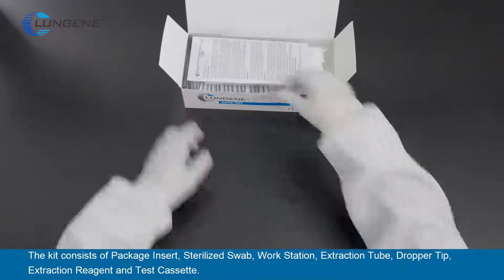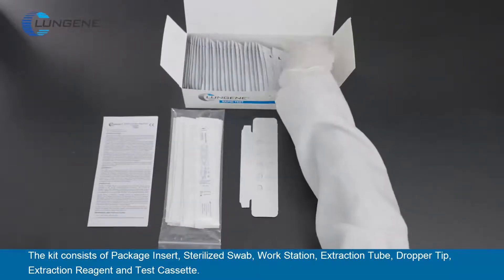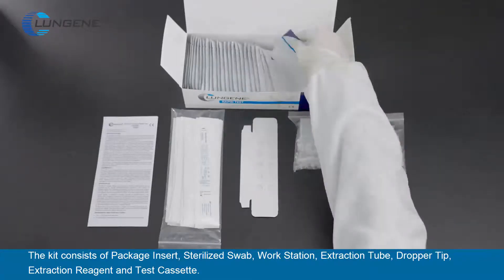The kit consists of: package insert, sterilized swab, workstation, extraction tube, dropper tip, extraction reagent, and test cassette.